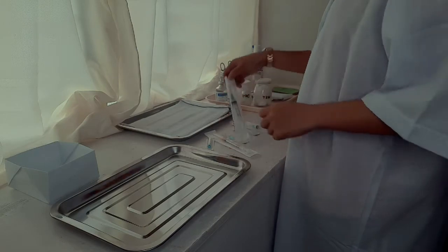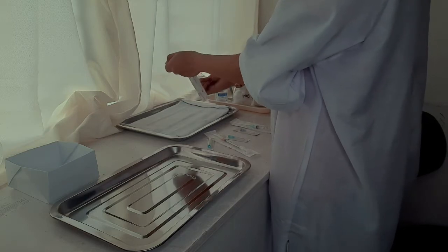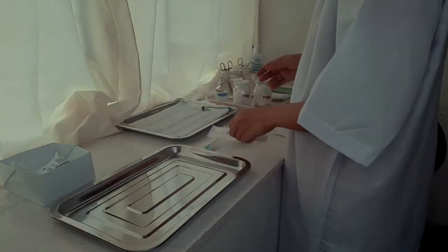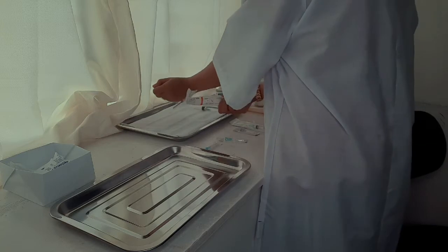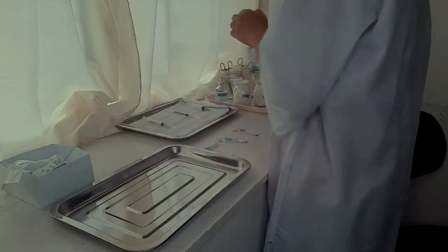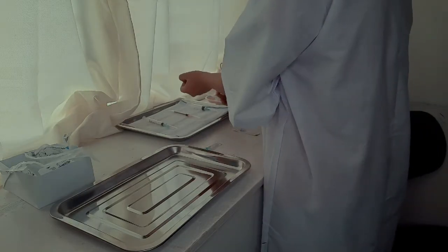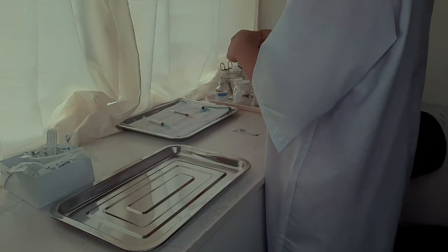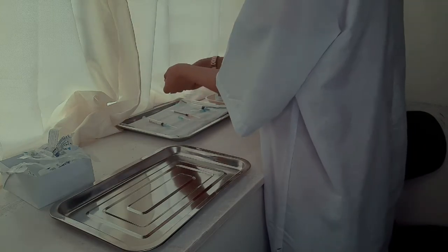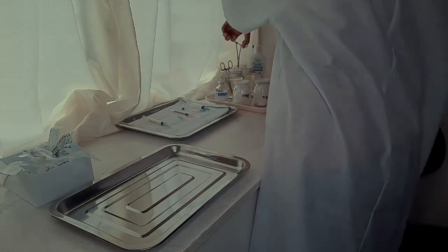Next procedure is to dispense the syringe and needles to a stock tray. Observe the aseptic technique in opening and dispensing the syringes and needles into the stock tray. Arrange the needles and syringes according to their use.